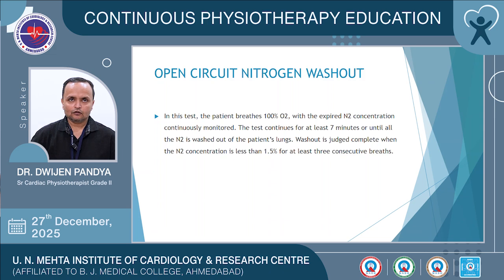The third test is the open circuit nitrogen washout test. The benefit of the body plethysmography test is that here the volume of air trapped in the lungs can be measured. Hence, it has a slight advantage over the helium dilution test as well as the open circuit nitrogen washout test.